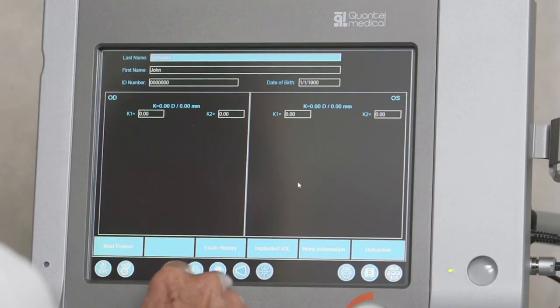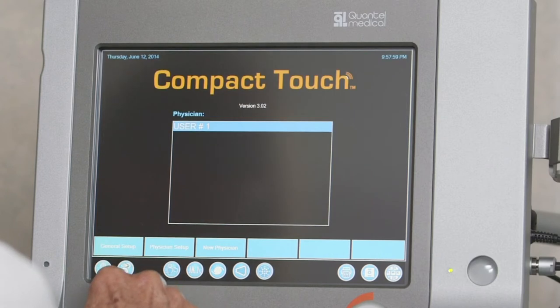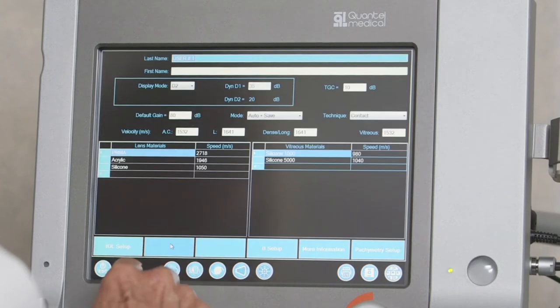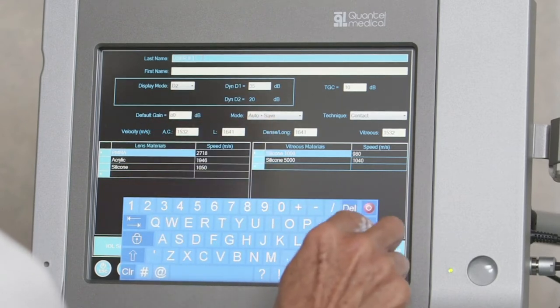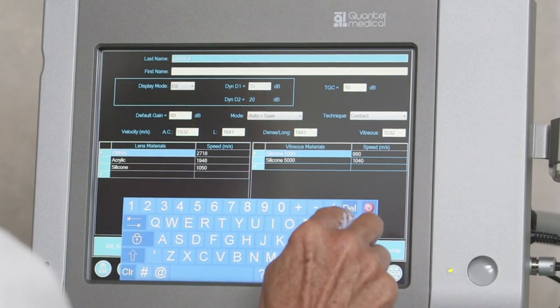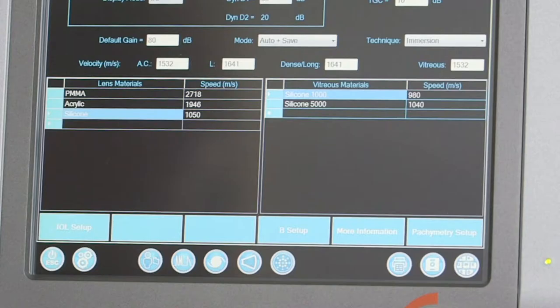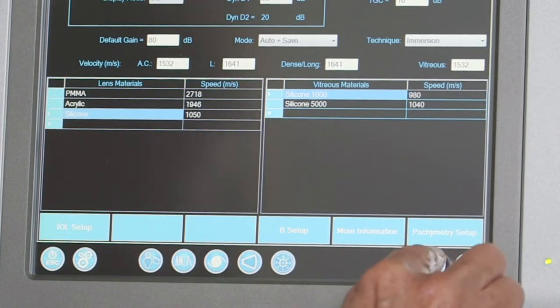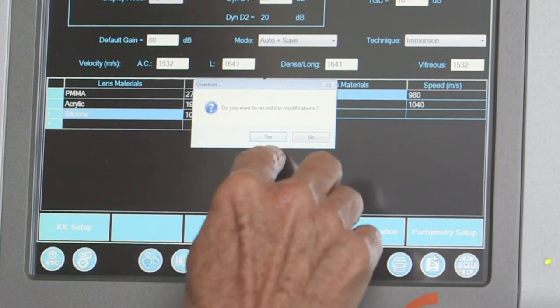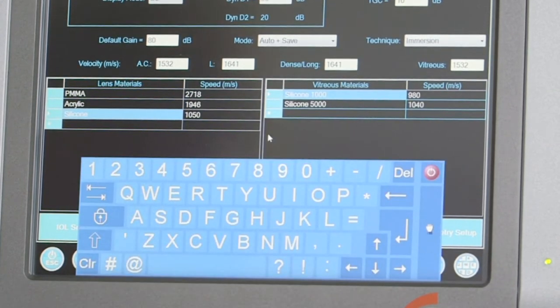A start-up screen is displayed when the system boots. A user profile can be chosen and modified by selecting Physician Setup from the bottom toolbar. Selecting New Physician creates a new user file. In addition to first and last names, default values for such parameters as Gain, Dynamic (DYN), and Time Gain Control (TGC) can be set. Once details have been entered, save the profile via the Save icon at the bottom of the screen.